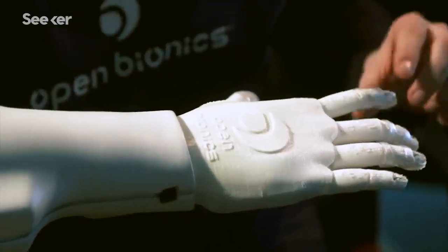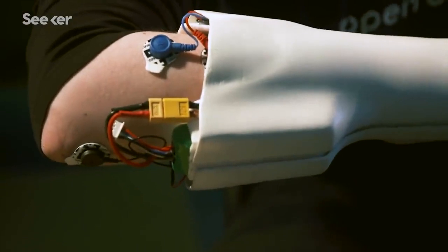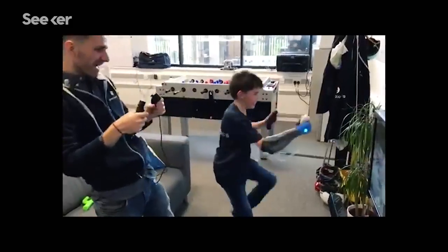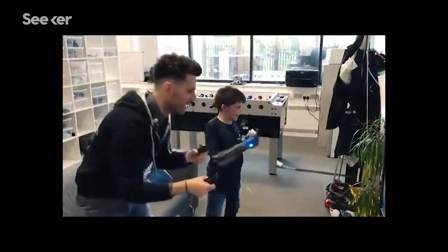One of the really cool things about the design of the Hero Arm is that it has adjustability built into the socket, so it can cope with a little bit more growth than usual — meaning that as a child grows, their prosthesis can grow with them.